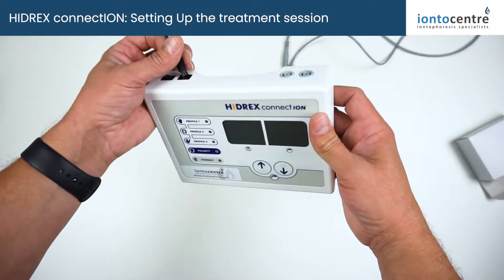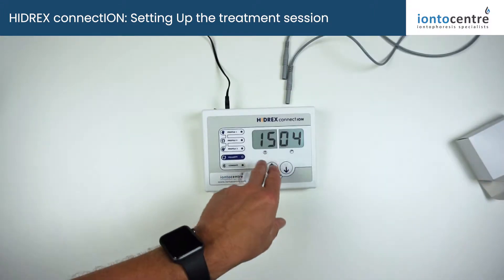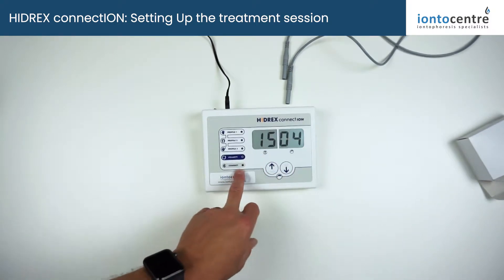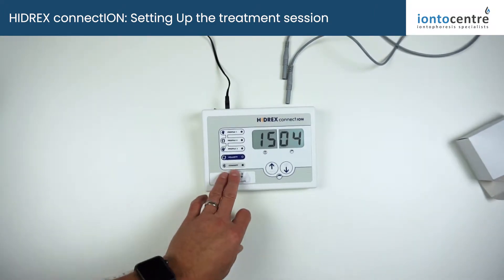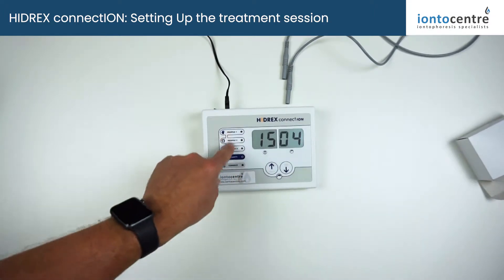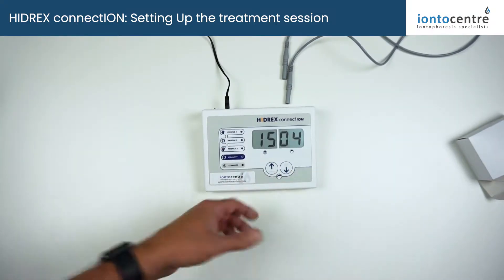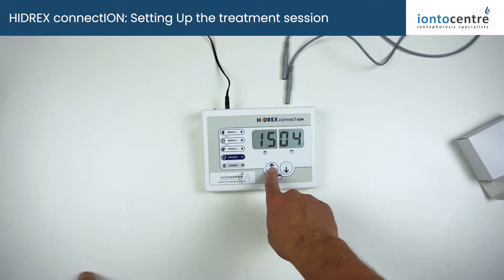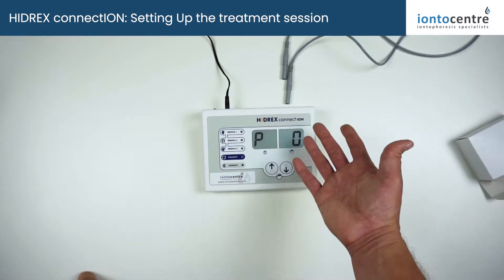The setup is really simple. The Connection has a backlit display. As mentioned in other videos, it has a pre-set 15-minute treatment time, which can be overridden in special circumstances via the app. The way you access your profile, memory storage points, and how you switch between pulse and direct current is by simply pressing and holding. Pressing and holding allows you to scroll through which of the presets you want, or none of the presets.